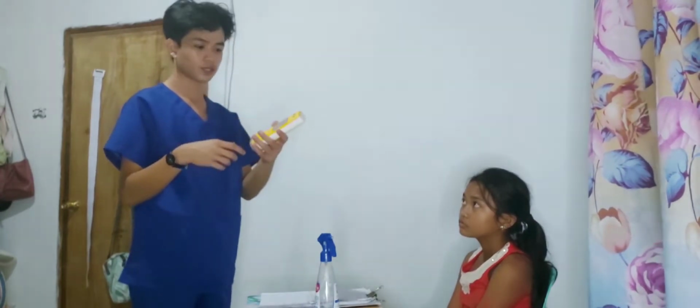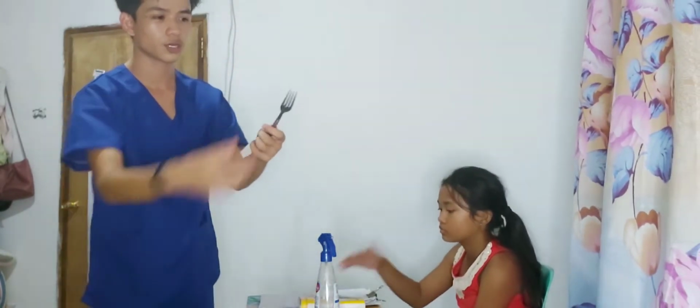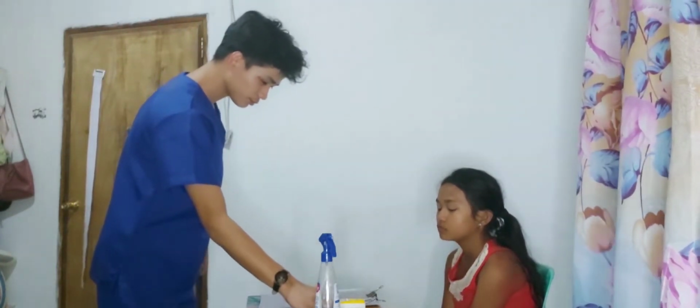After that, we're going to gather all the equipment that we will be needing. I have here a watch with a second hand. Let's just pretend that this is an otoscope because I don't have that kind of equipment. And also the tuning fork. Let's just pretend that this is a tuning fork. Prepare the client in a comfortable position. Nasa comfortable position naman siya.